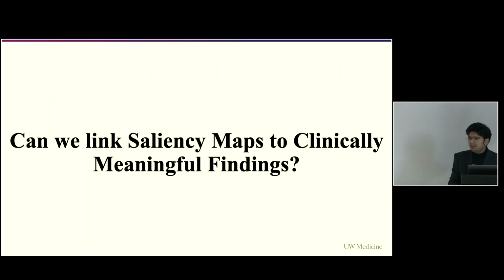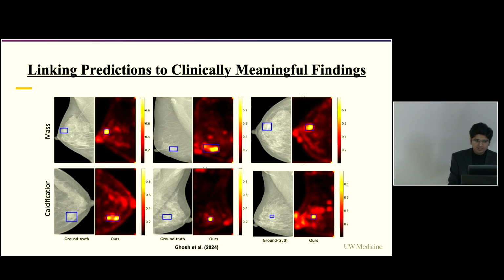Now, the real question is, can we link these saliency maps, these heat maps, to clinically meaningful findings? Could we harness AI applications for medical image processing and henceforth drive more clinical knowledge discovery? So first, let us see this particular case, wherein we would have some input imaging data and some saliency map which would be generated.